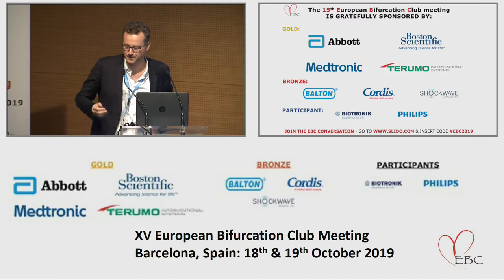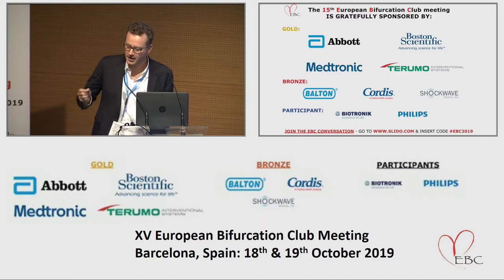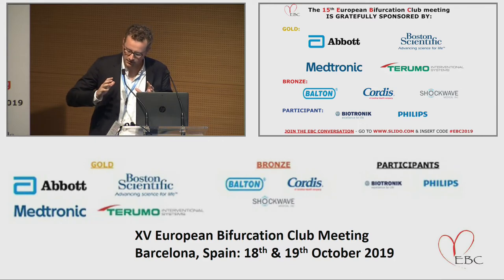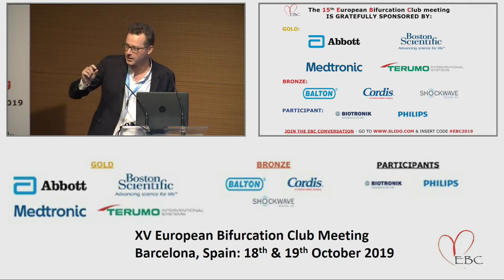It's like the comparison in French, I don't know in English, but in French we say it's like haute couture and prêt-à-porter. That means we try to take the stent, the balloon will give you better accuracy, not accuracy, but to be closer to your target in terms of diameter.